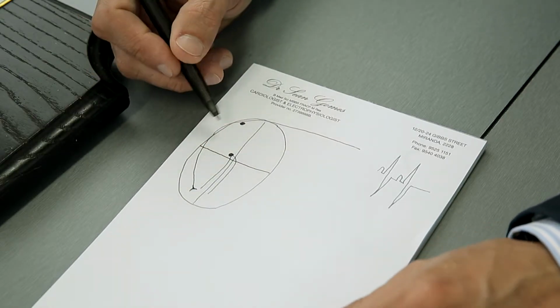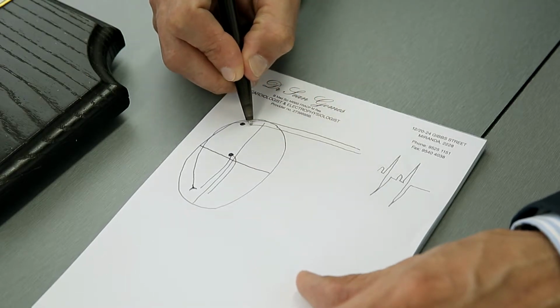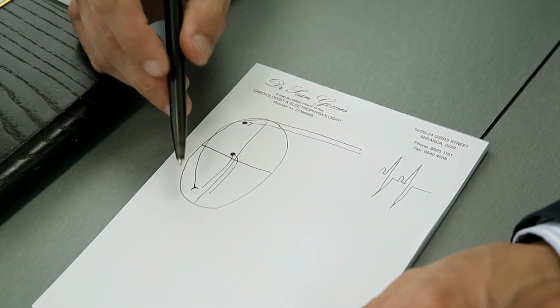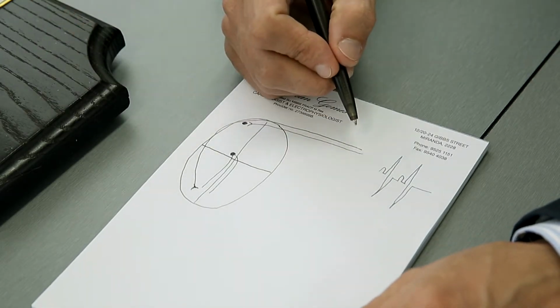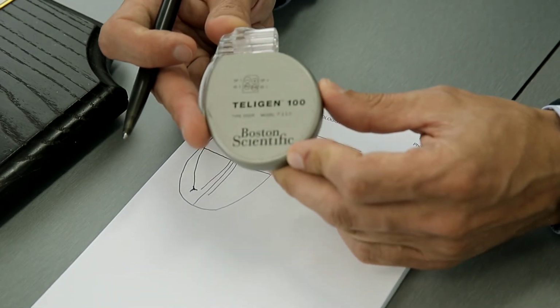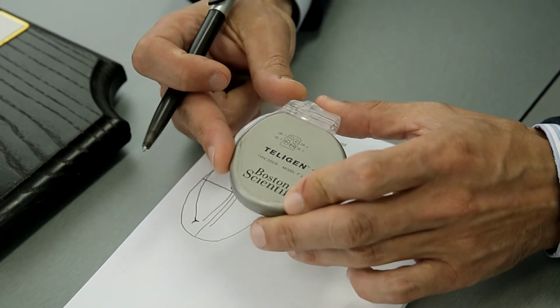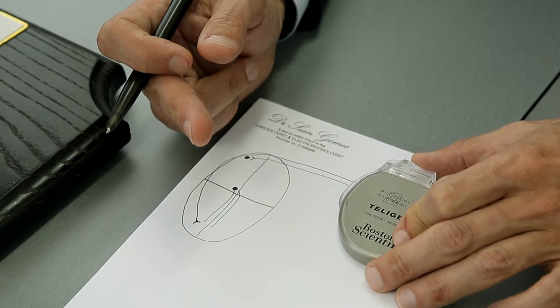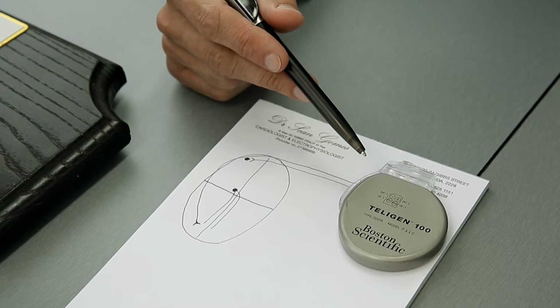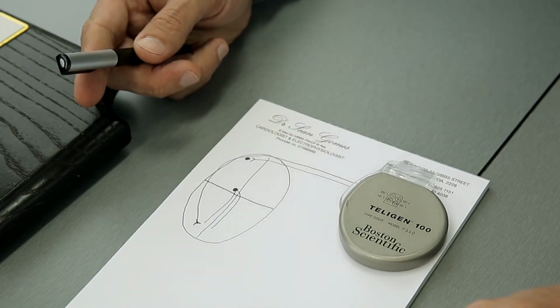We'll have a wire at the bottom of the heart. In some cases, we may have a wire at the top of the heart, or even a 3rd wire that runs to the back of the left side of the heart. The wires attach to a battery, which is a generator. This is a typical ICD generator or battery. Those wires will attach back up to the battery. The generator or battery will be put into the wound. The wound will be sewed up, and then the procedure will be complete.